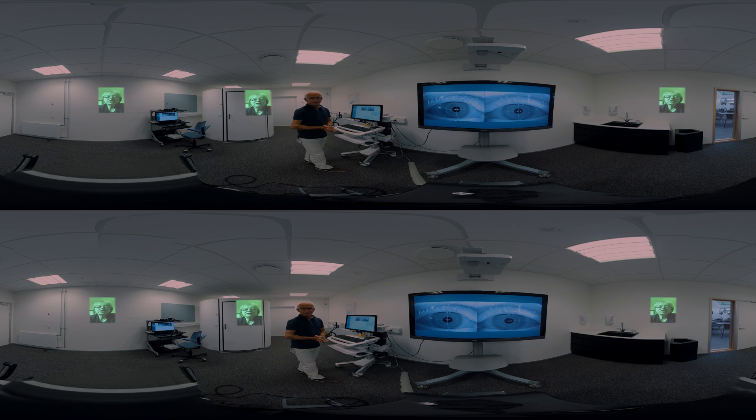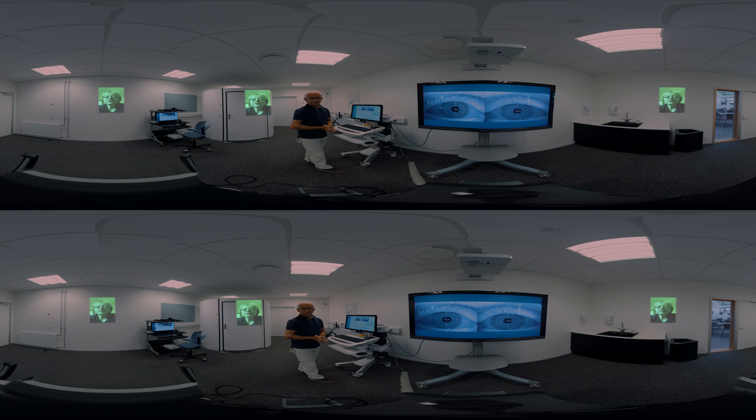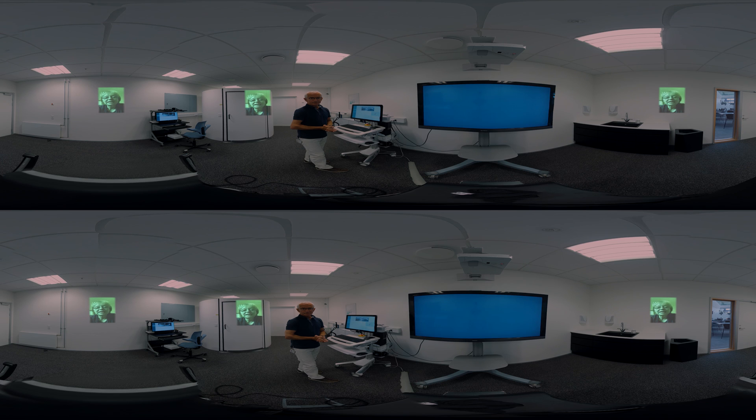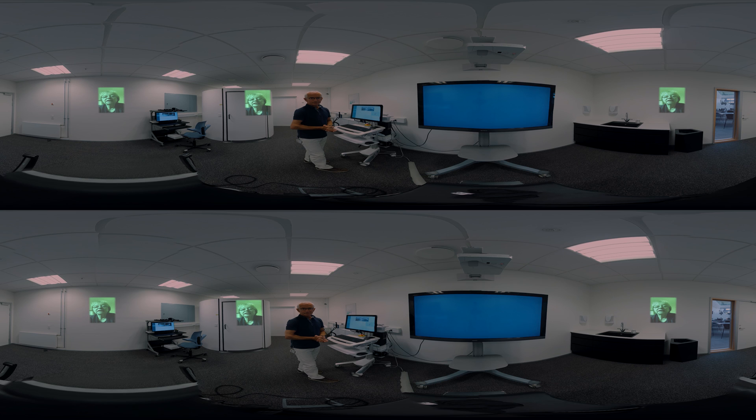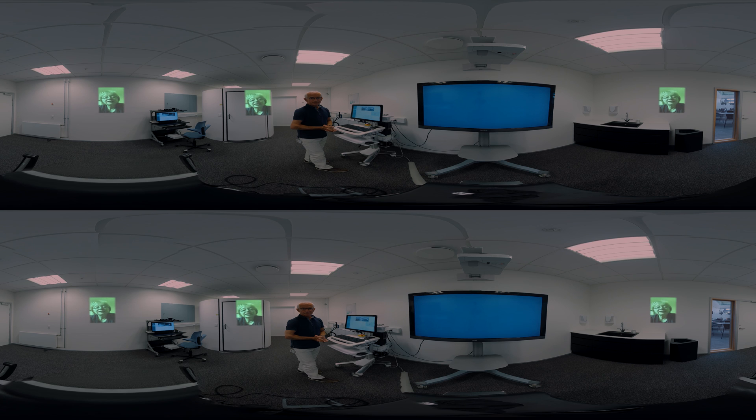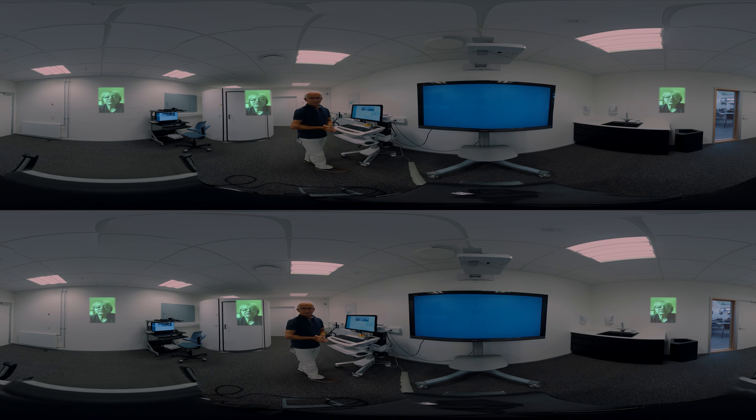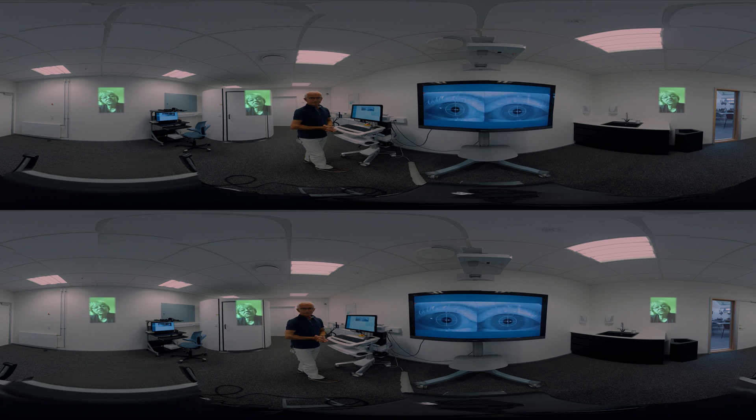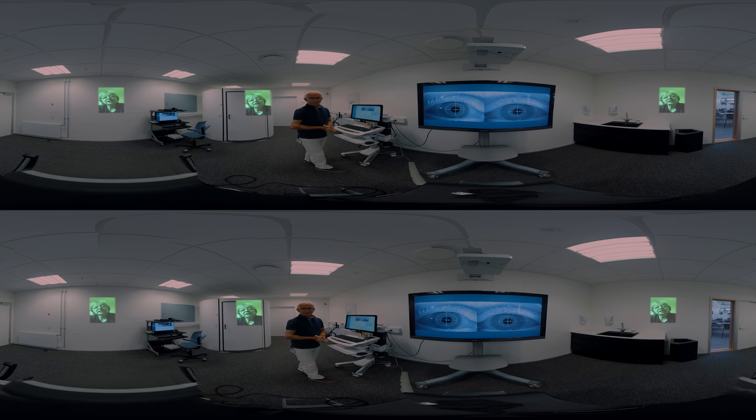We've also added a little vortex sensor and this is such a great device. It's tiny, it's wireless, it clips onto my existing goggles and it gives me head movement feedback. This allows me to do the active head rotation test and dynamic visual acuity. Both of these tests are very important in the diagnosis of a bilateral vestibular weakness.